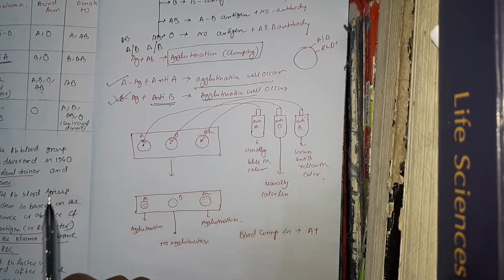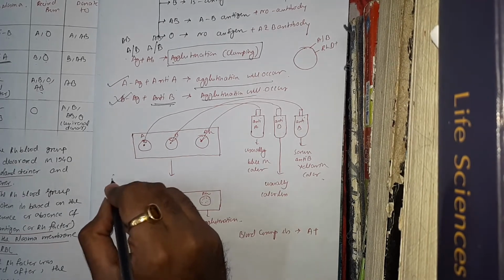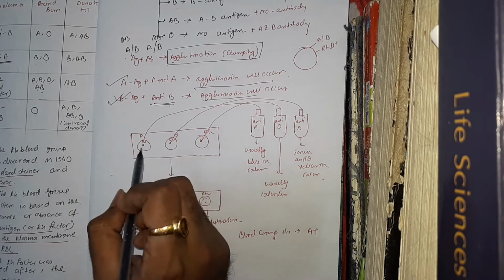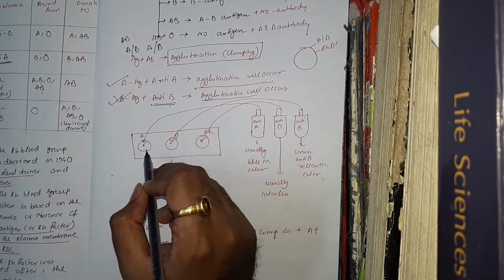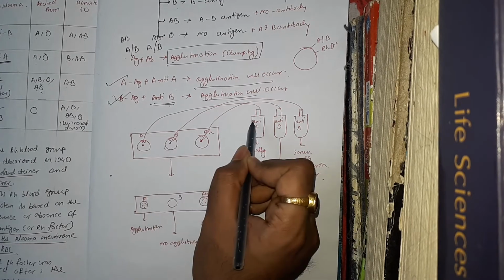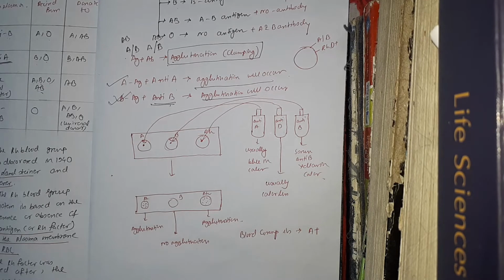I will mix it. And remember one thing, you have to be very cautious that the blood must not be intermixed. That is number one, and secondly, when you are mixing the antibody with the blood, make sure that it will not mix with other areas. Suppose by mistake you add anti B into the anti A marked area, it can give a faulty result, as you cannot figure out what is going on, right? So that is the idea.